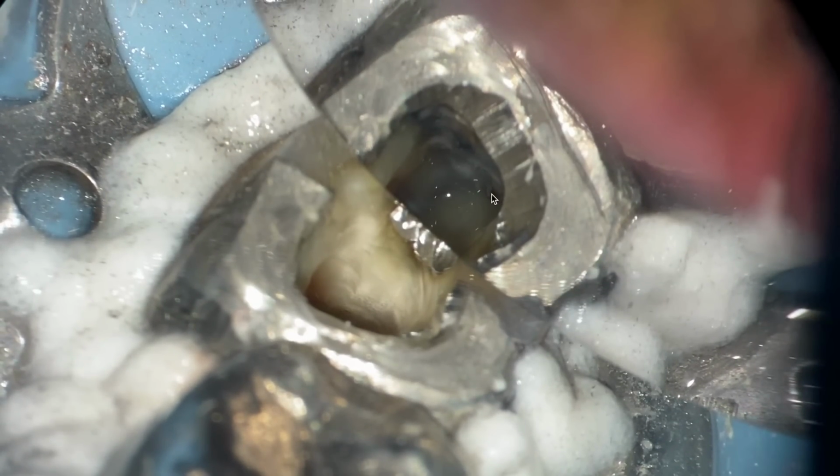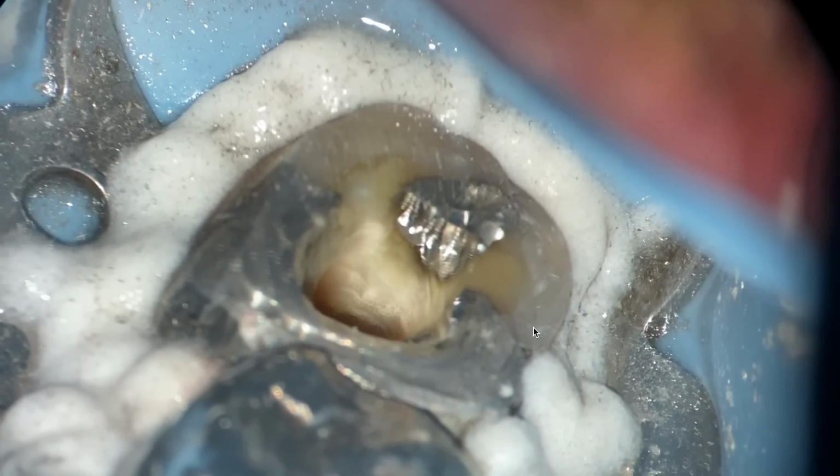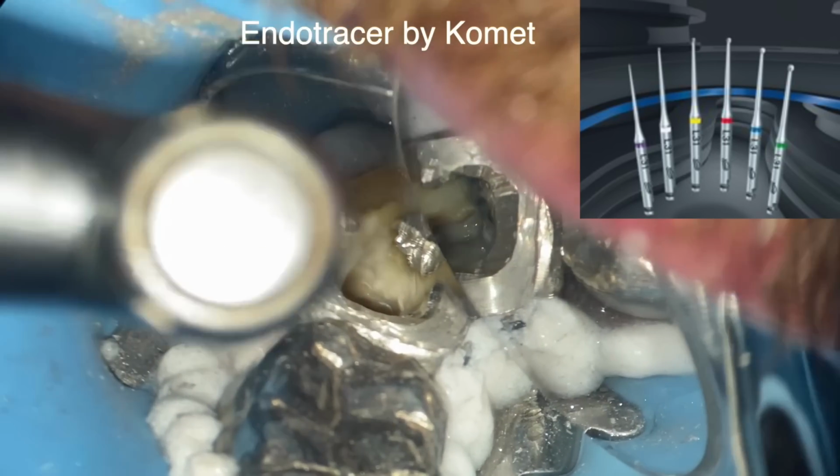All right, so here's our mesiolingual. We've opened the coronal two thirds. And what we're going to do here is actually use a Muntz burr or an endo tracer burr. Actually, it's cheaper. They're by Komet. They're more available worldwide. And I don't get paid by anybody.